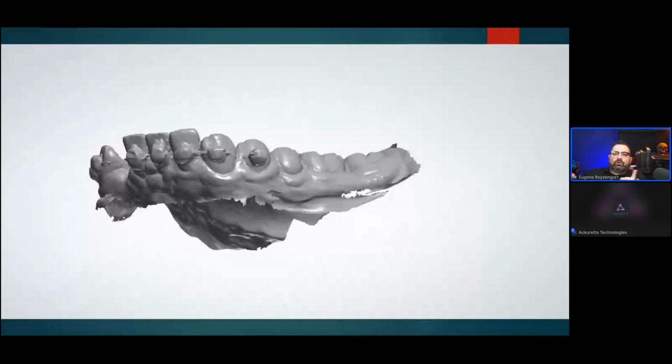One thing I do want to warn you guys about: when you're dealing with these resins for teeth, if it's a highly filled ceramic one, there's a specific protocol for washing it, because the second that stuff touches alcohol, it starts to get that white film on it, which you will later need to get rid of. But if you adjust your cleaning protocols, and you can reach out to these companies and they can show you how it's done, you can minimize the amount of cleaning you need to do from the resins.